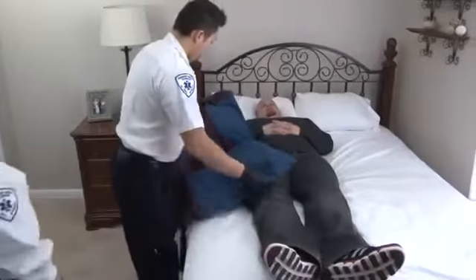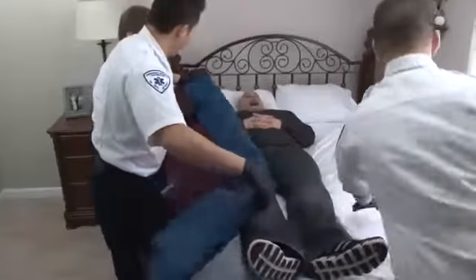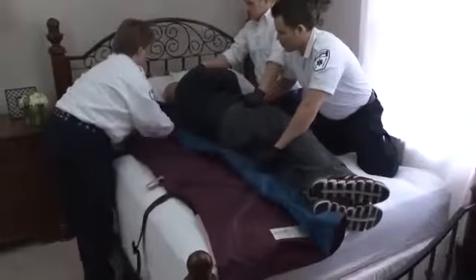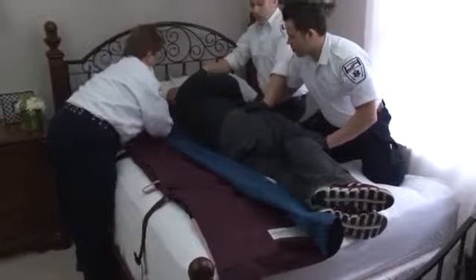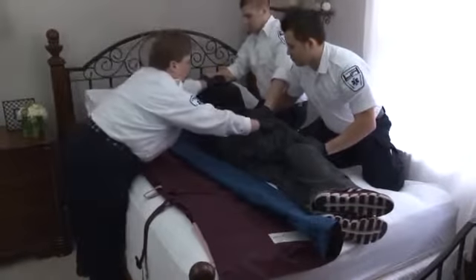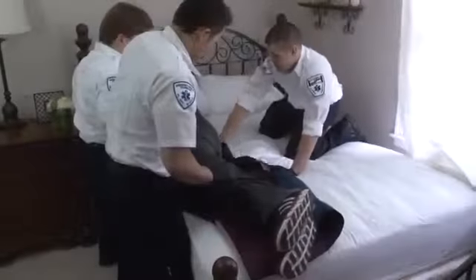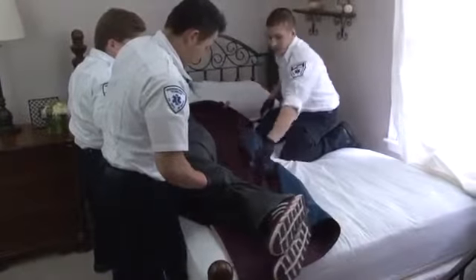If the patient is in bed and needs to be evacuated from the home, transfer the patient onto the inflated Evacuation HoverJack 2 using the HoverMatt air transfer mattress, if available. Begin by log rolling the HoverMatt air transfer mattress underneath the patient, making sure the side with the label is facing up and at the patient's feet.